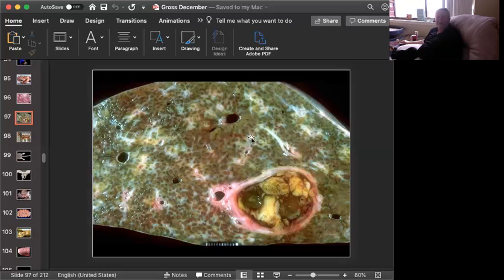If you look at this, you can see there is extensive fibrosis, which outlines the portal areas because we have post-hepatic obstruction here. So this is all fibrosis due to the obstruction of this large bile duct, and then you have a tremendous loss.